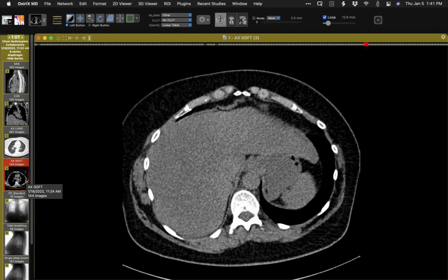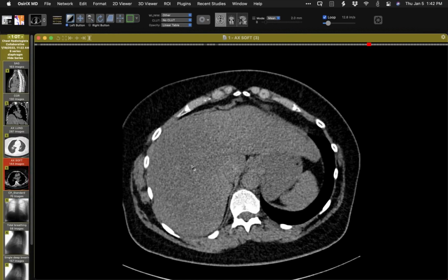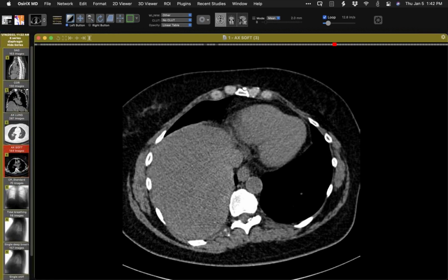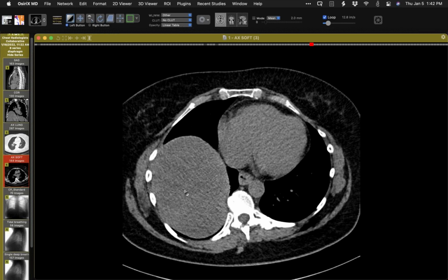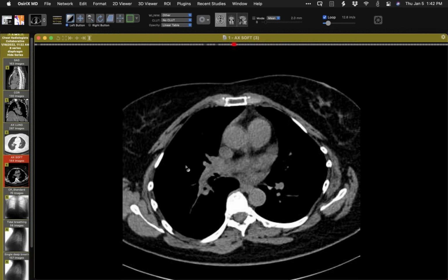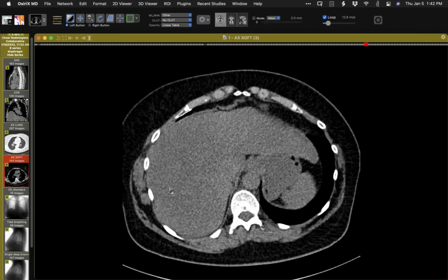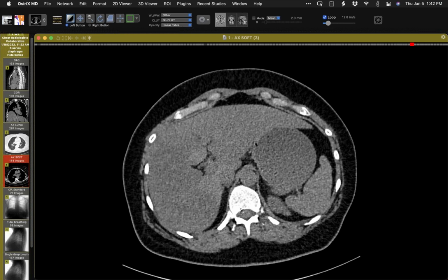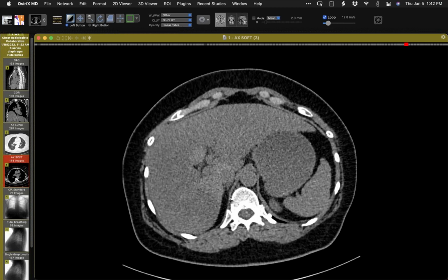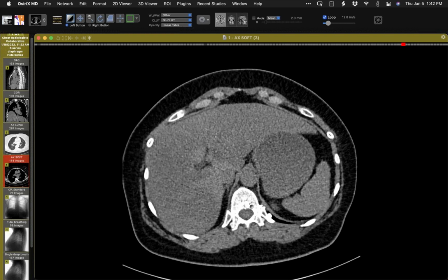I'm trying to think if I had a more recent CT to look at, but let me just try to remind myself about this case. There was another CT, and there was also, and I thought I kept it, an MRI examination that I could look at that was involving the lumbar spine. And I could use that to show that, as you see here, there is no atrophy of the posterior right hemidiaphragm muscle or the crus. And that was also the case on a previous CT and MRI.